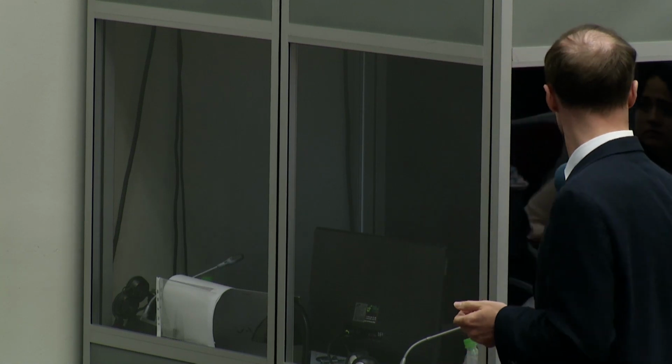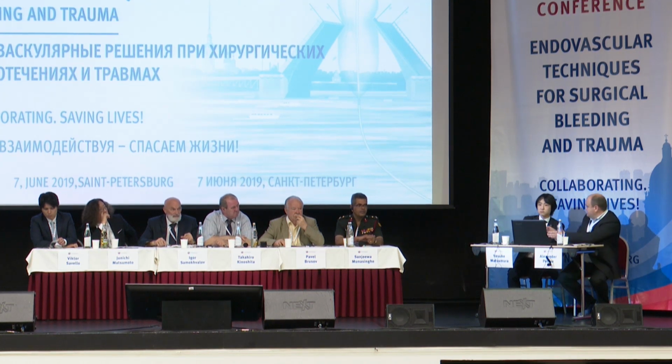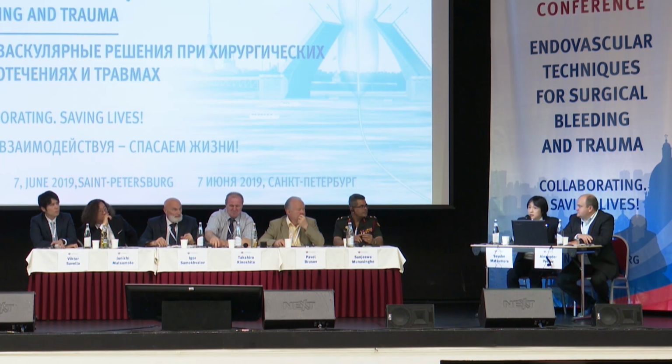Yes, we do in our center, but we probably don't use the REBOA balloon. We use other balloons in different arteries for clamping either iliac or popliteal arteries. As for REBOA, we don't use it in our center, but all the other endovascular interventions are done by endovascular surgeons. They are on duty 24 hours. Thank you.